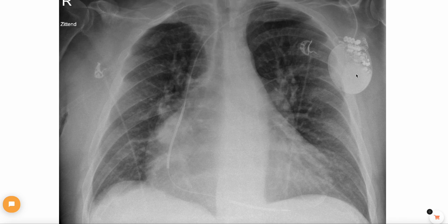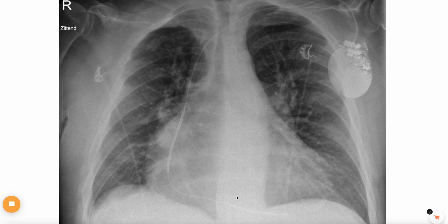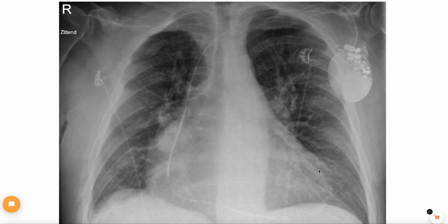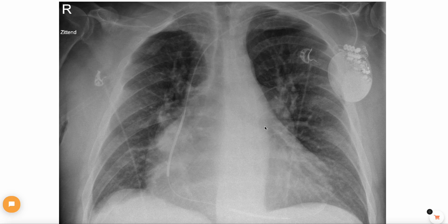In some cases you have a CRTD — a cardiac resynchronization device and defibrillator — where there is also an epicardial lead on the left ventricle. As with the pacemaker, this epicardial lead on the left ventricle is placed through the coronary sinus in the right atrium. This is done retrogradely, because the direction of flow through the coronary sinus is actually into the right atrium, but the cardiologist inserts the lead through the coronary sinus and retrogradely fits it on the epicardial side of the left ventricle.